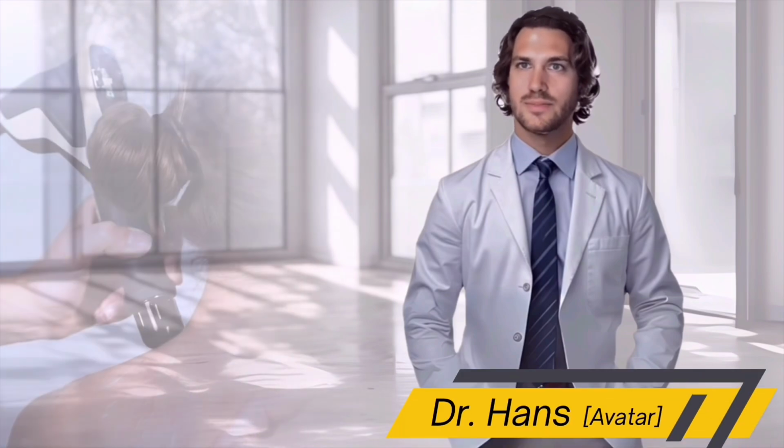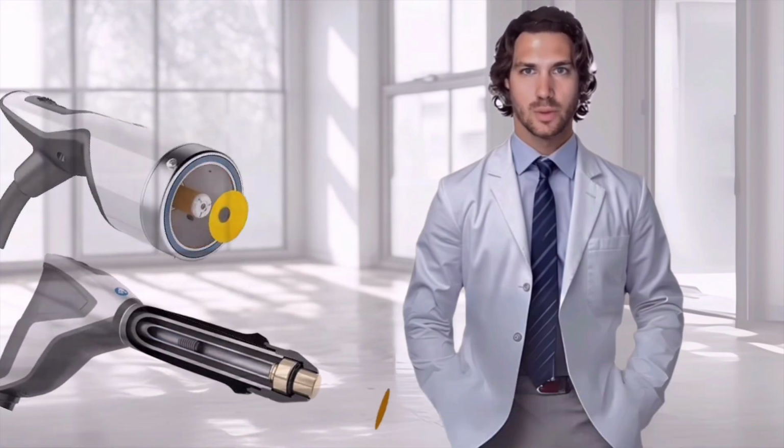In this video tutorial, I'll demonstrate the cardinal application techniques and movements used in both radial and focused shockwave therapy.